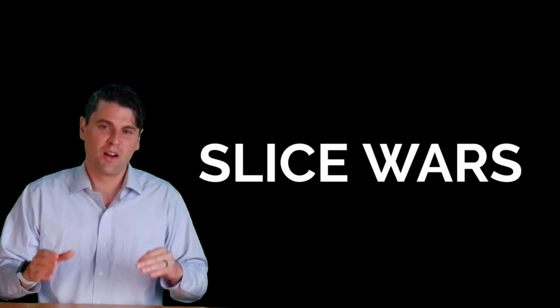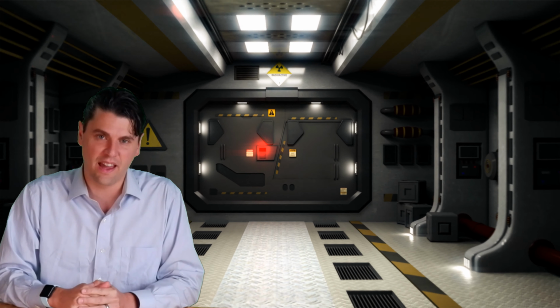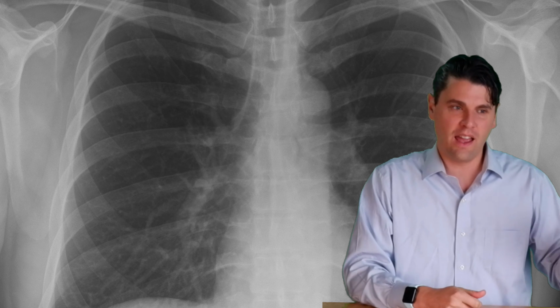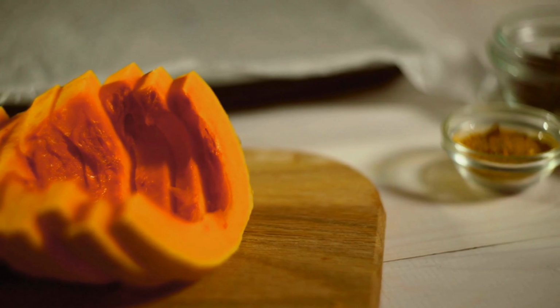Several years ago, in the mid-2000s, there was what we call the slice wars, where all of the vendors were trying to increase the number of slices on their CT scanners at once. What I'm going to call axial non-volumetric scanning is when we have, say, 16 or fewer rows in the detector. And rows in the detector is really what matters. You can make an arbitrary number of slices in your images. Sometimes the vendors like to talk about the slices a lot, but for the purpose of today, I'm just talking about rows in the detector.